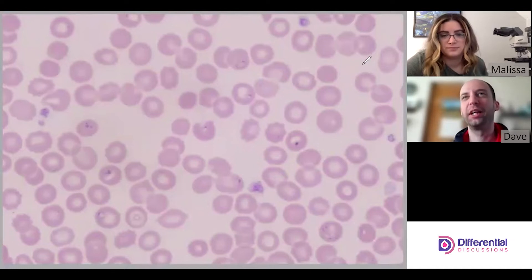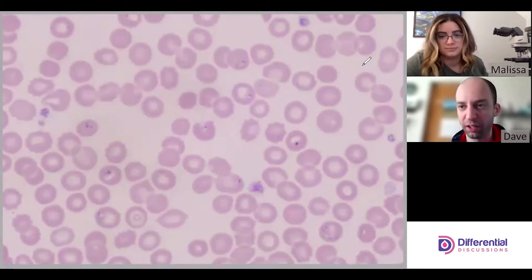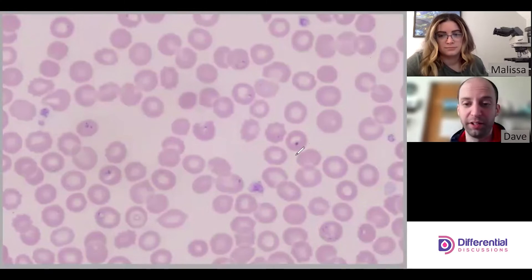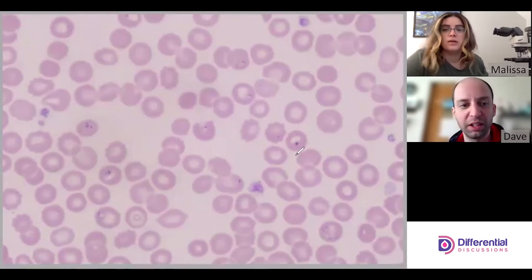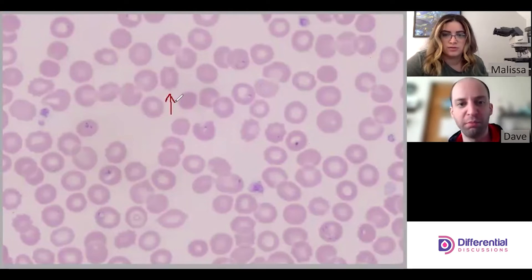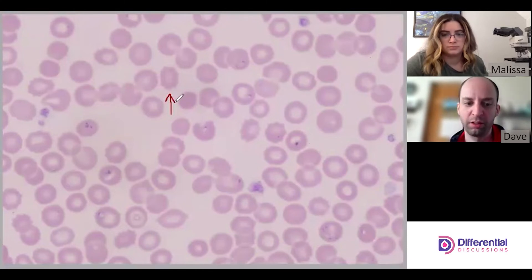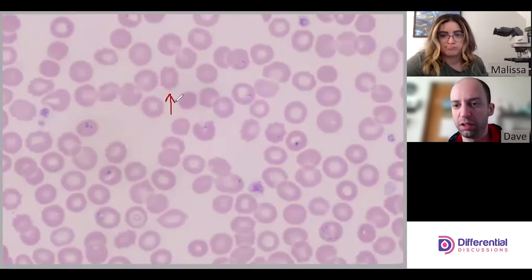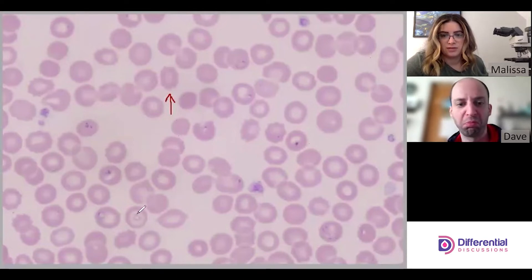Whereas Plasmodium falciparum tends to be somewhat consistent with one another — there's always variability, but Babesia shows much more morphological variation. Other than the parasites, there are some echinocytes, which is pretty common with blood parasites generally. There's something here but I think it's just an artifact, not a true codocyte.